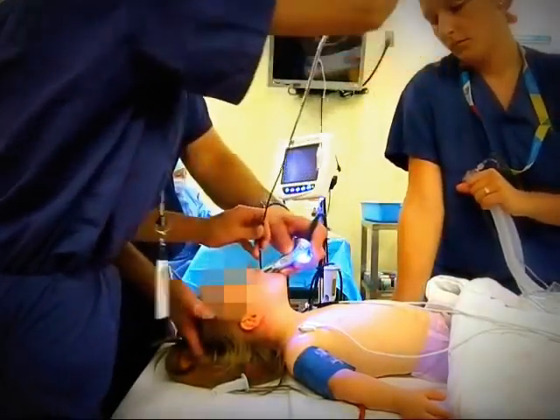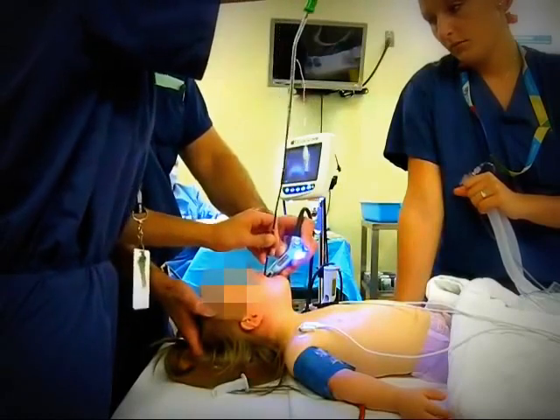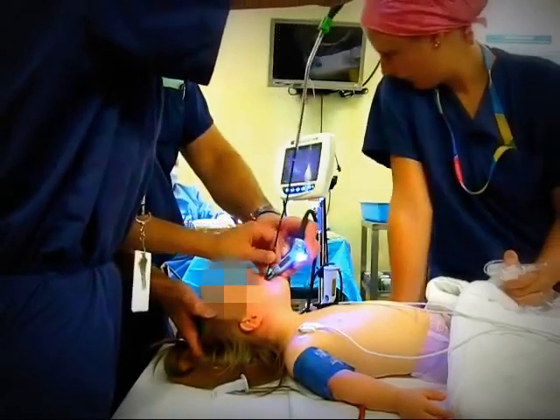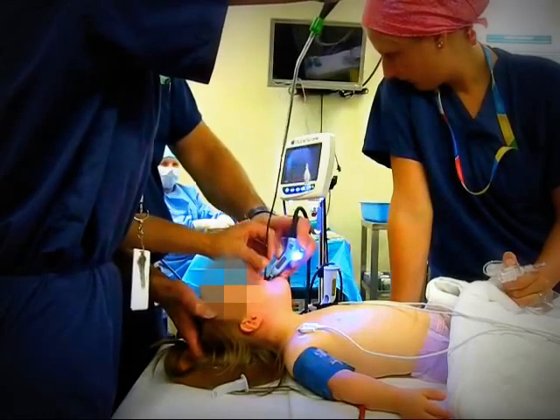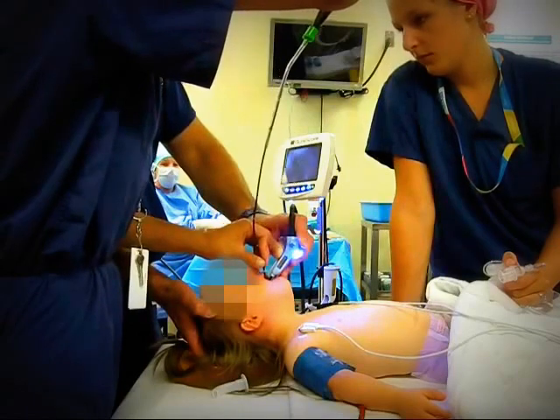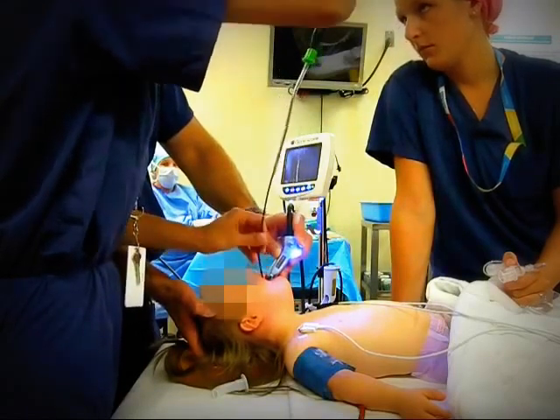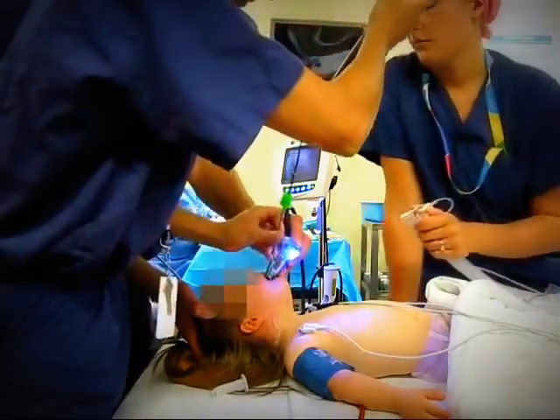The tip of the fiber optic scope is found on the video laryngoscope screen. At that point, the fiber optic scope is inserted through the vocal cords and sent down into the trachea towards the carina. The endotracheal tube is then railroaded off over the fiber optic bronchoscope.